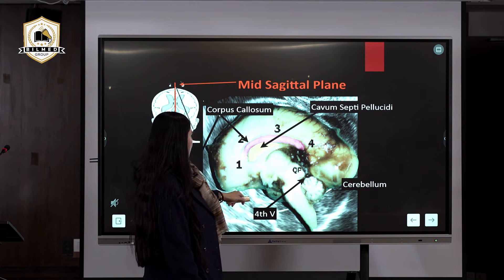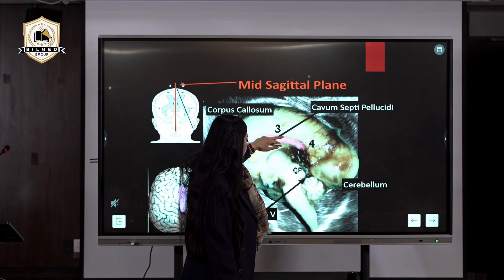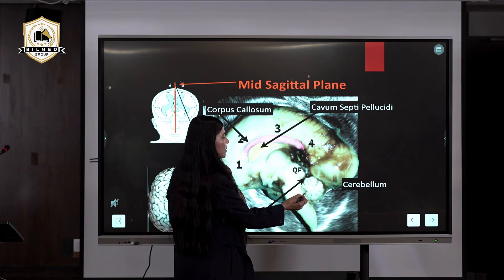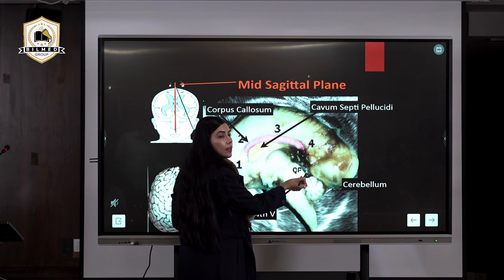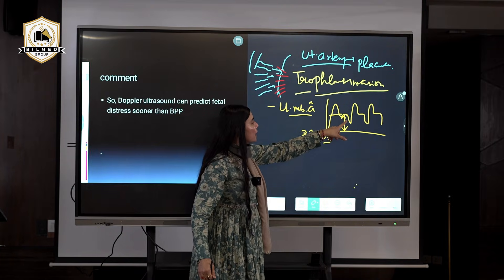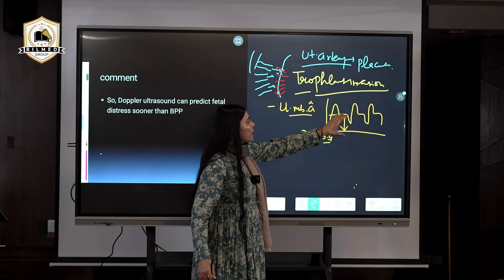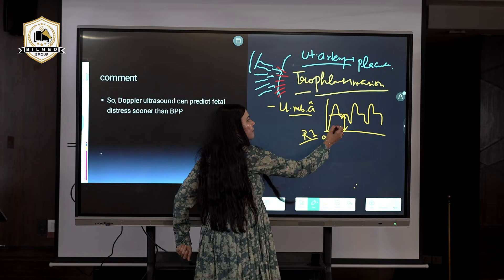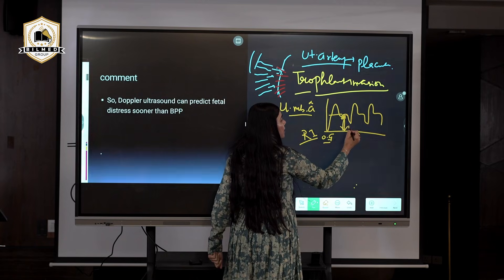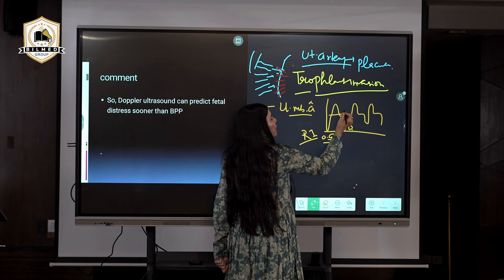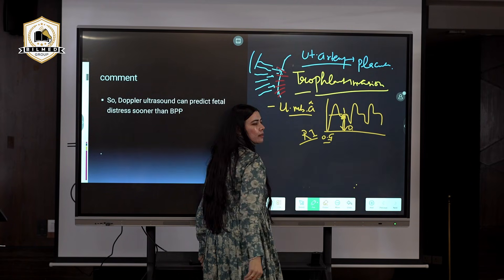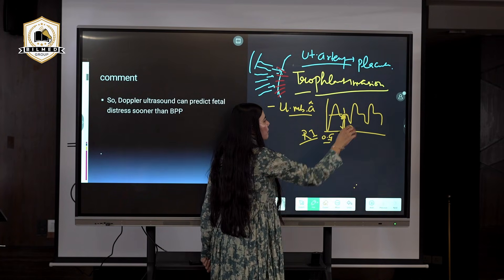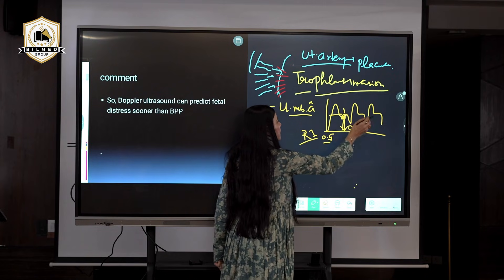The ventricular system is coming. Fourth ventricle, where I told you this is cerebellum. In front of cerebellum, as the age is advancing and this diastolic flow is increasing, this value starts coming up. That means it is high diastolic flow. The moment you are getting three consecutive good waveforms, the machine will auto-trace it for you.